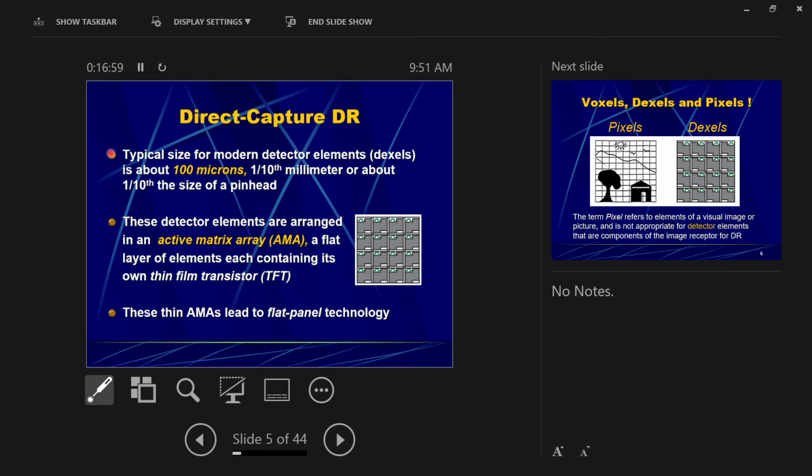What was dynamic range associated with? Grayscale, right? Remember we talked about bit depth, dynamic range, and grayscale. Bit depth was in principle how many shades of gray your computer could achieve for an X-ray image. Remember, it's color on some things, but in X-ray we talk about shades of gray. Dynamic range is how many shades of gray are made available to the computer to use.